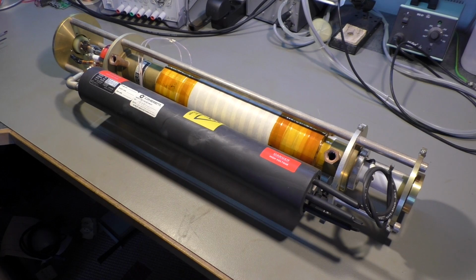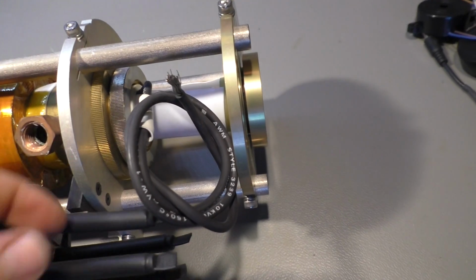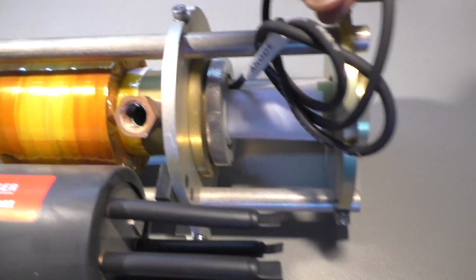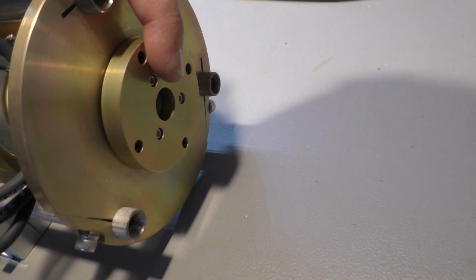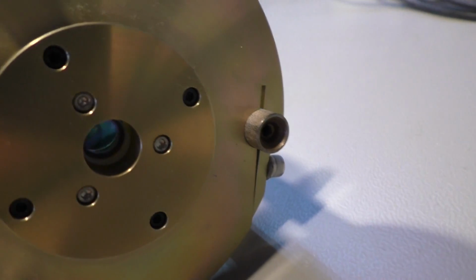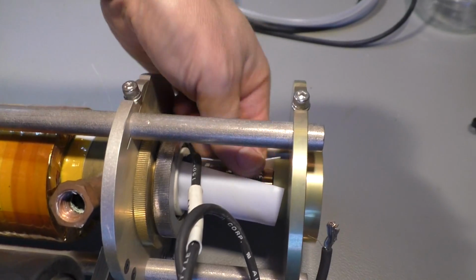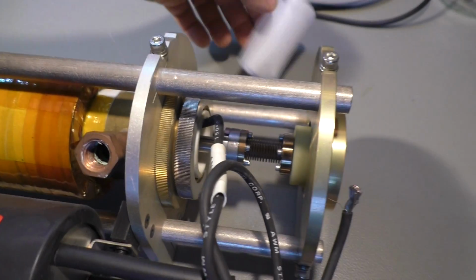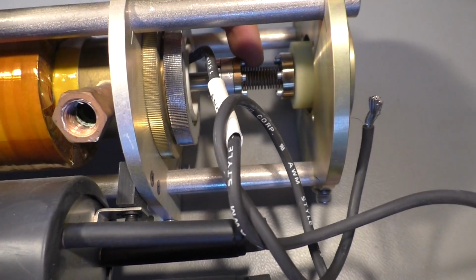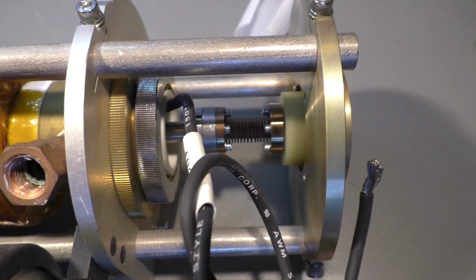Well, let's have a look at the tube. So this side is the anode. This is the output window where the beam comes out. You can see the output mirror here. Then we have a little bit of insulation around that. Here is a flexible gasket because the mirrors can be adjusted mechanically.